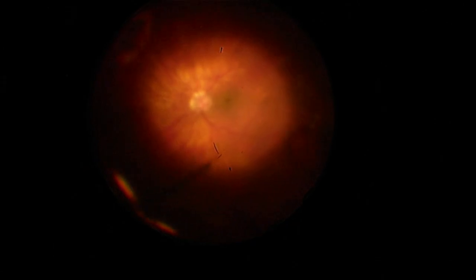For a good fluid exchange, it's ideally best to create a central air bubble for improved visibility before addressing the tear directly, where we will aspirate all the subretinal fluid from within the tear, closely monitoring the transition level between the air and the fluid, aiming to aspirate as much fluid as possible.